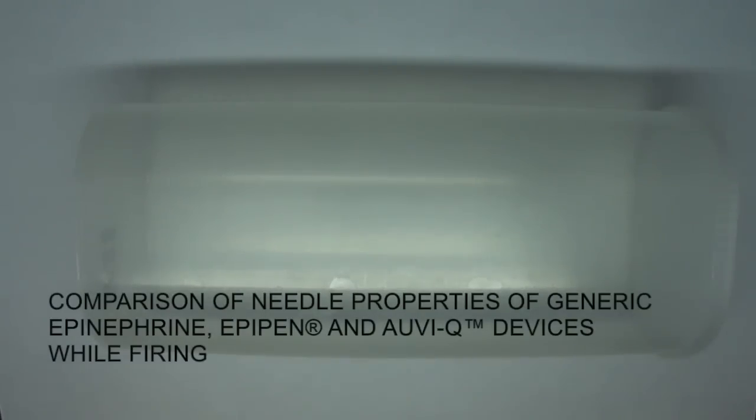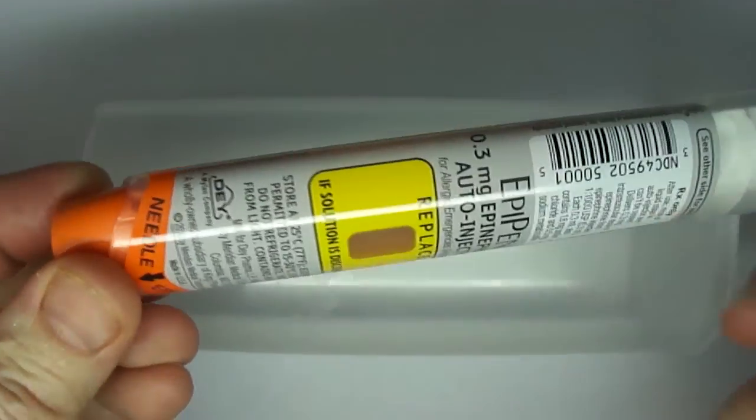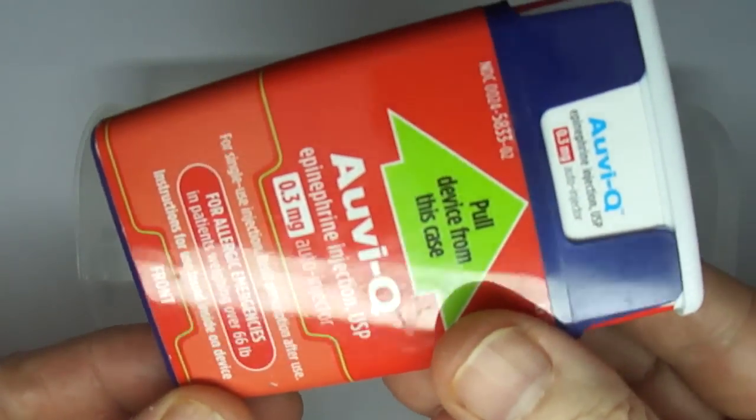I'm using this plastic container to show the difference between a generic device that doesn't have a needle cover, an EpiPen which has a needle cover, and an AviQ which has a self-retracting needle.